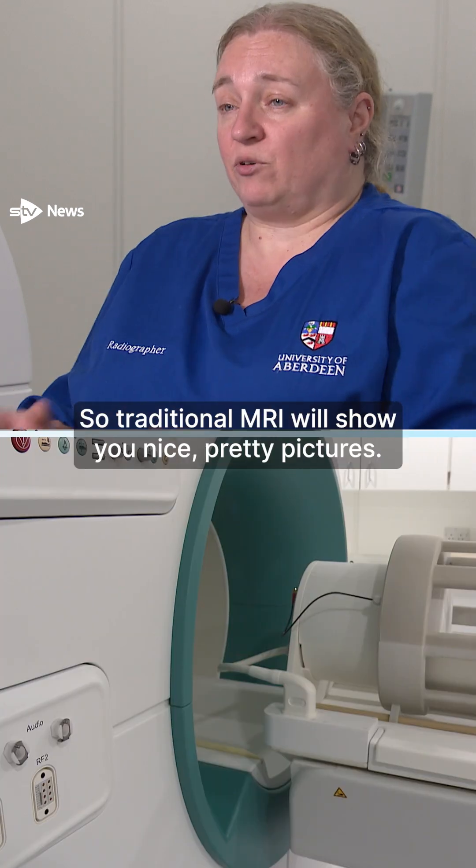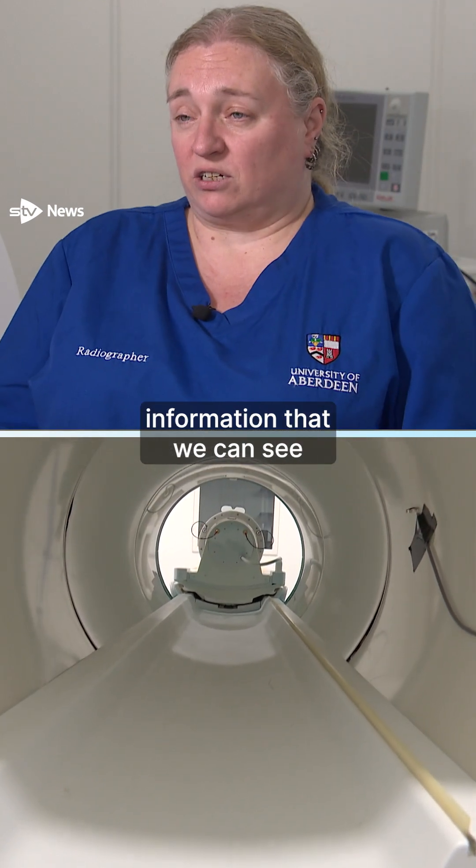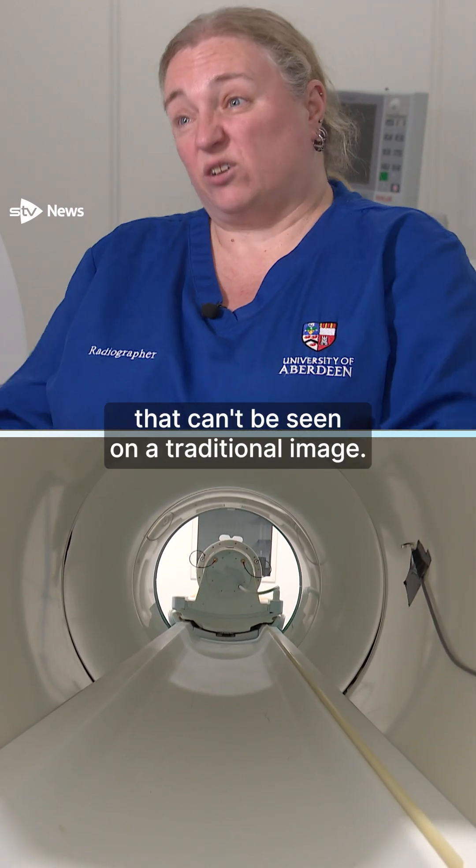Traditional MRI will show you nice pretty pictures. What we're interested in is the background information that we can see that can't be seen on a traditional image.